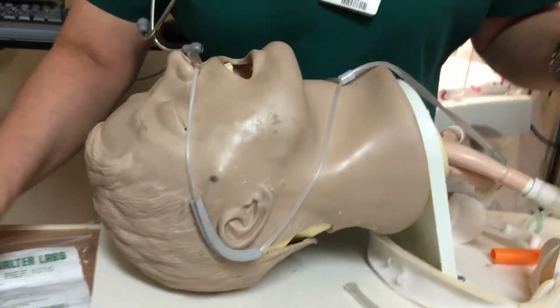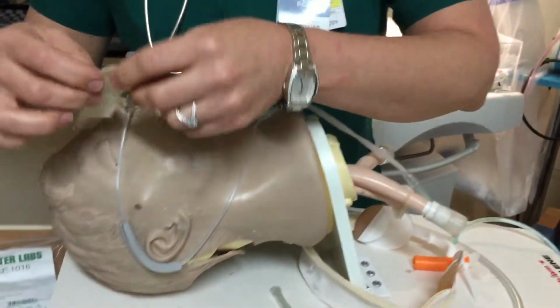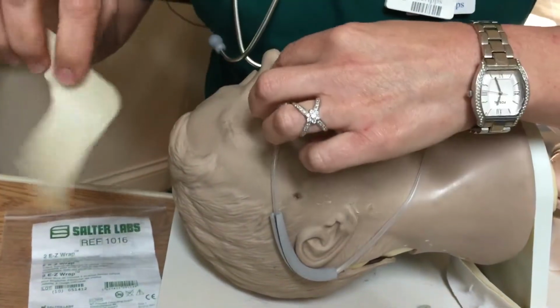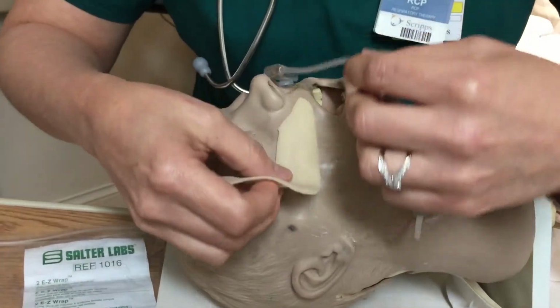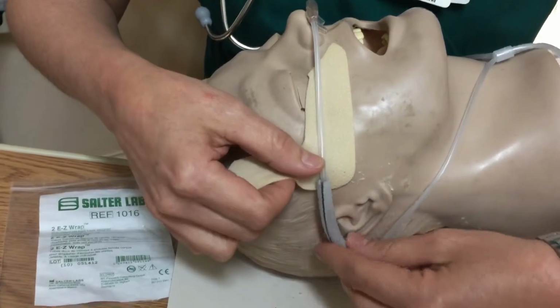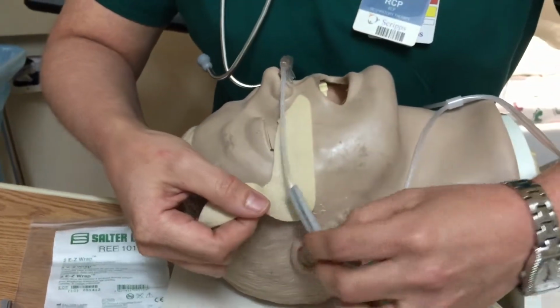Another thing nurses are doing is that they're wrapping these areas with Mepilex. So if patients have a potential area for skin breakdown, you can apply Mepilex just like this. Remember, the goal is to do as little harm to the patient as we can.